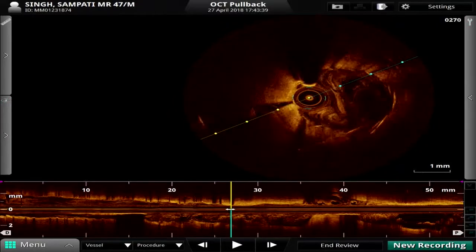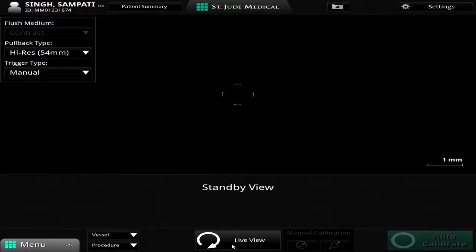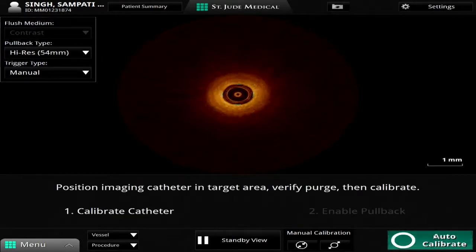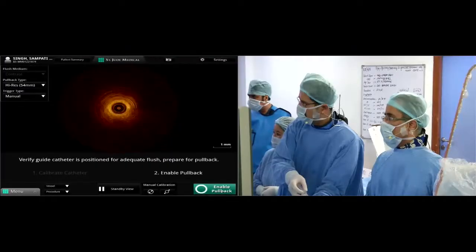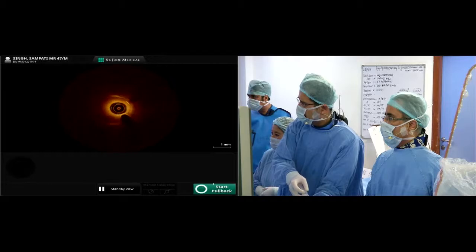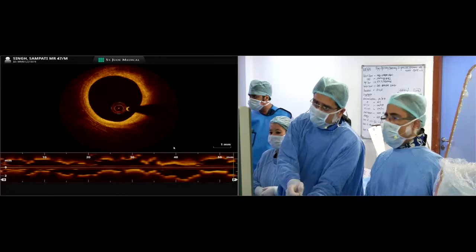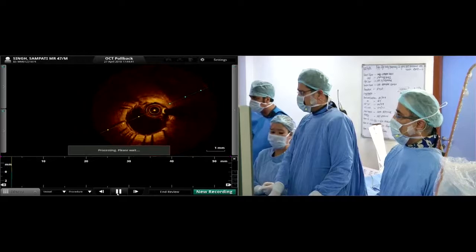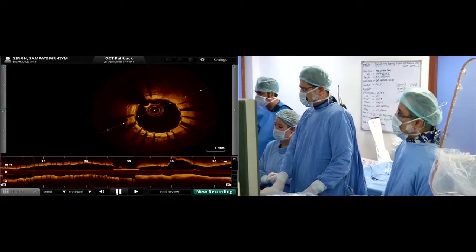So should we have another run? Check. Okay, ready? This is good. So sorry about that, the first run was not really appropriate, so we got another run, and this looks pretty good. So move slow.